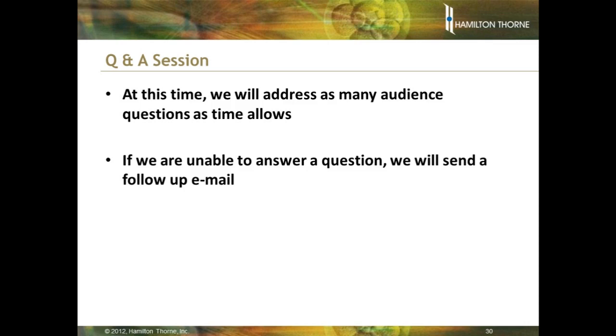I would say in specific circumstances, if you have a fantastic cryo program and you can identify those patients that will freeze well, then go ahead, be my guest. But I would say to preach this to everyone is a mistake, because results demonstrate, international statistics show that freezing does compromise embryos overall. Maybe not in every specific program, but overall, freezing is not benign.